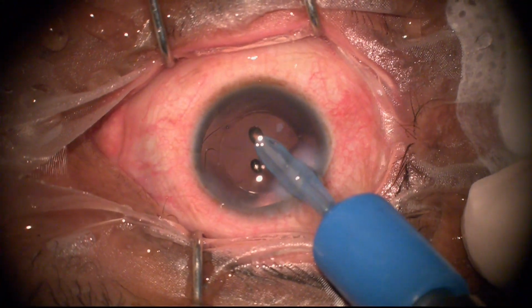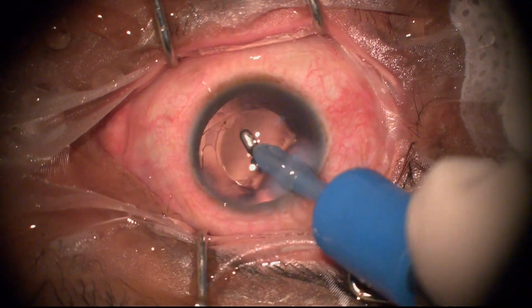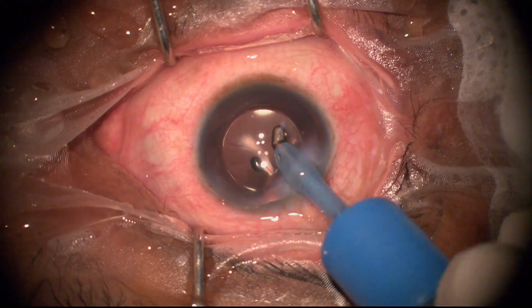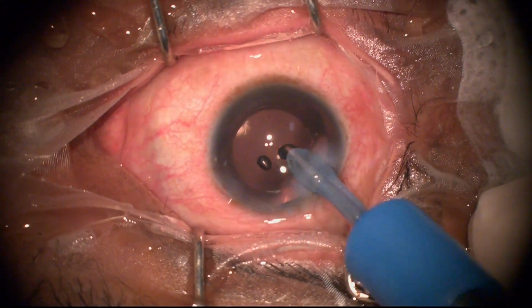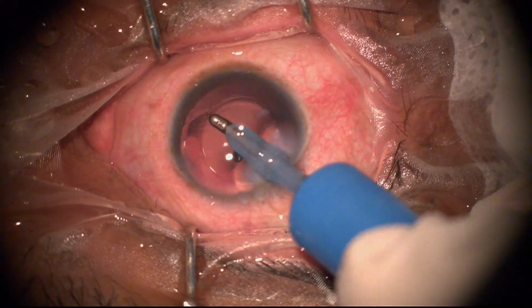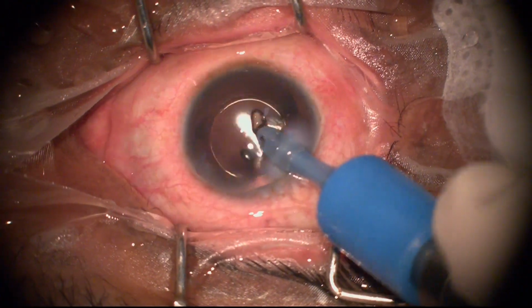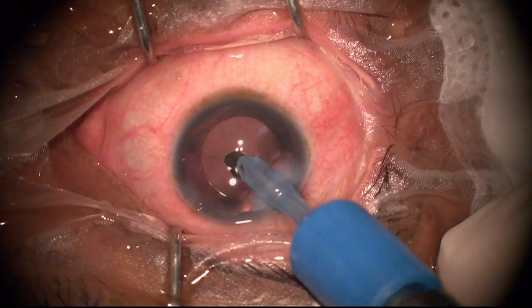Vitrectomy. Whatever the reason, ultimately it was my responsibility that if I felt that it was inadequate to use the syringe to flush and not do IA, that is my responsibility. So don't take blame on yourself. But I am just letting you know why I pointed it out, when you offered me a syringe for flushing rather than IA.